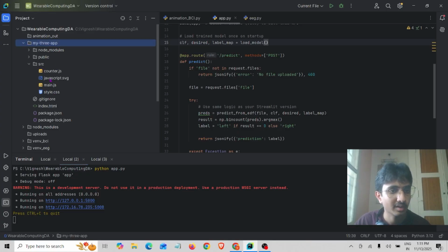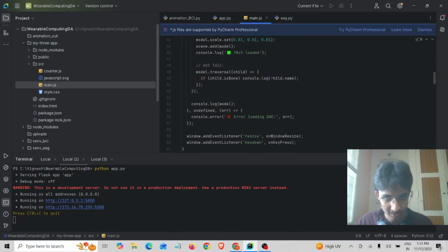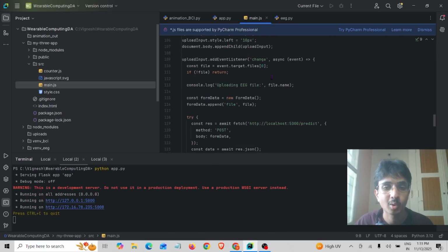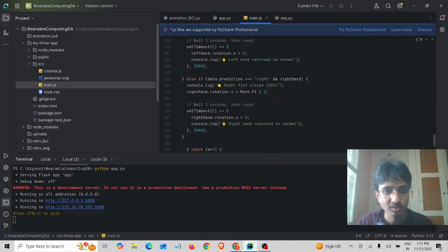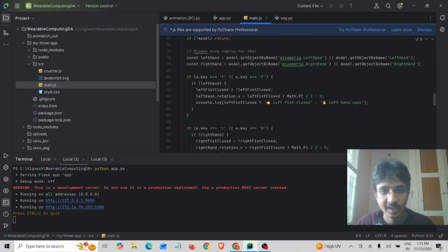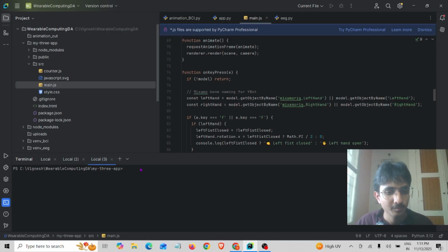So this is the file which contains Three.js. In the source file, this is the main part where we use Three.js to simulate a Y-bot, the pre-made model which is available on the internet, and we will use this to make the robot move its hands based on the predictions done by our Flask server. So let me run this as well.